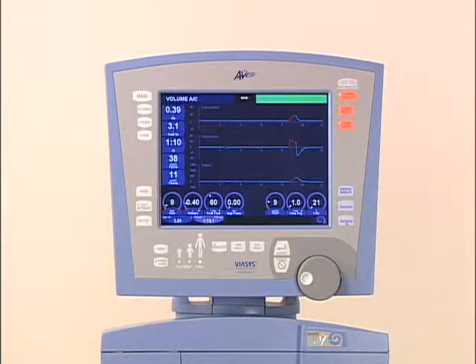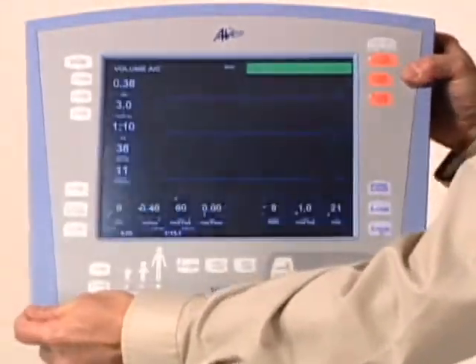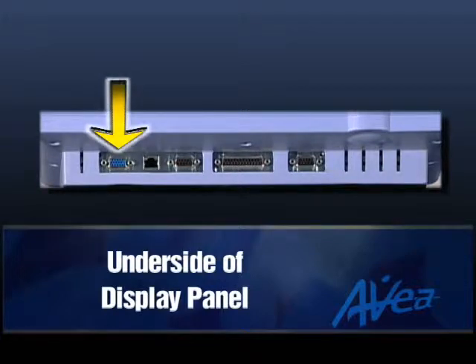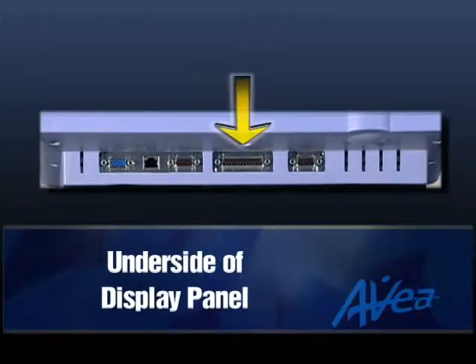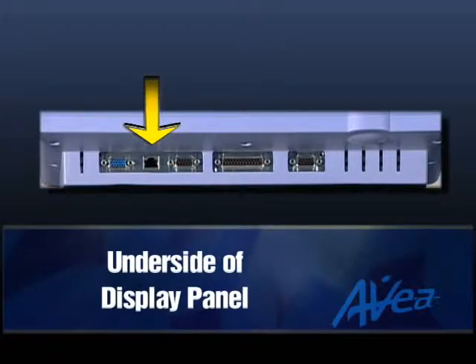The user interface module is where patient settings are input and all monitored data is displayed. The display can be easily adjusted for optimal viewing. On the underside of the display panel, an SVGA port is provided for direct output of screen displays to a digital projection or image capture device. A parallel printer port allows printing of any screen display. The RS-232 port is for the input and output of digital data and makes software upgrades quick and easy. An MIB port is provided for interfacing with medical information systems.